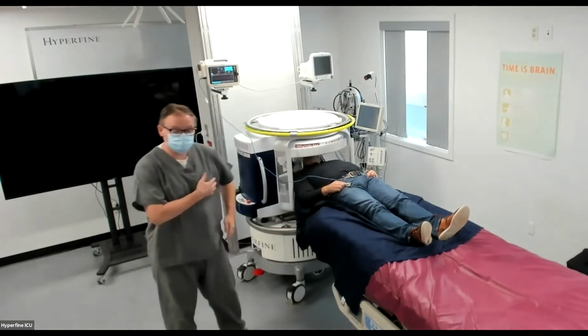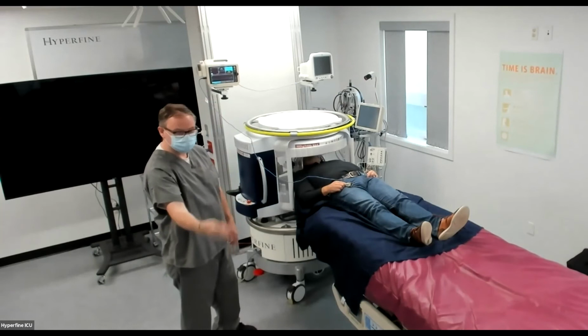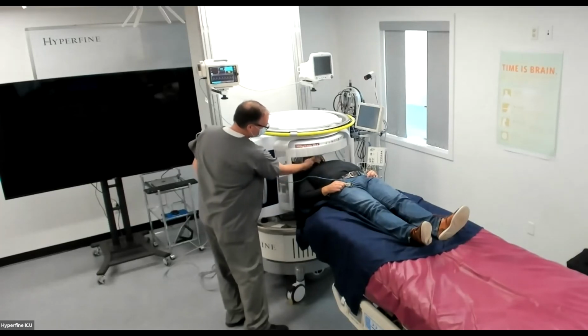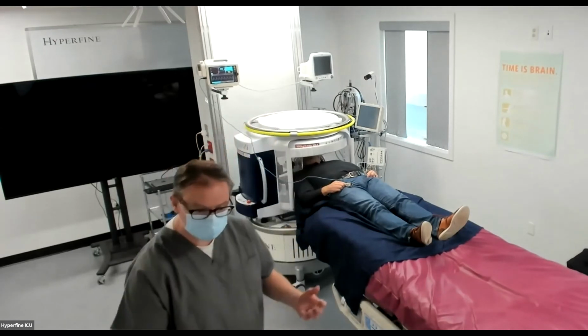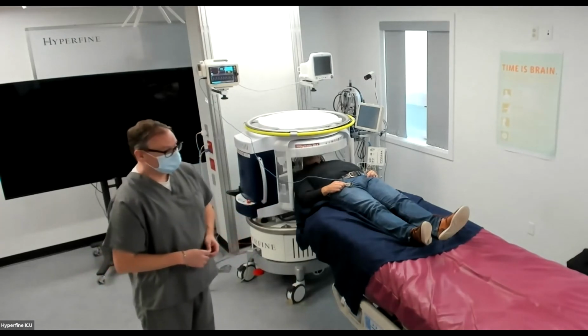Oh, I promised to show you the strength of the field. So I'm going to take this keychain here and show you that it'll just barely grab it. And it doesn't put John at risk at all. It's very gentle. It's not like a bullet or a projectile effect really at all. We've had patients with oxygen tanks wheeling right past it as we moved it through the neuro ICU at Yale.